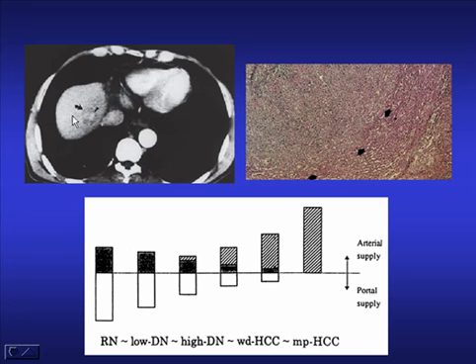And this is due to a fundamental property of the liver with its dual arterial and portal venous blood supply, and the transformation of normal liver tissue to tumour tissue involves the progressive switching of blood supply into the pure arterial phase and away from portal venous supply.